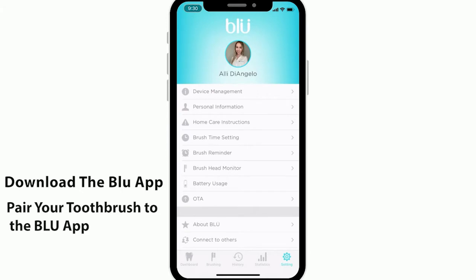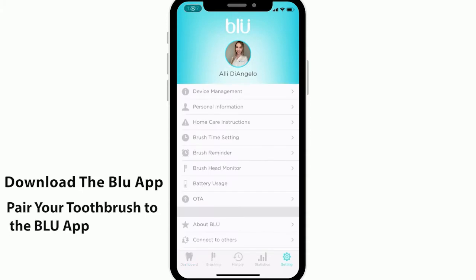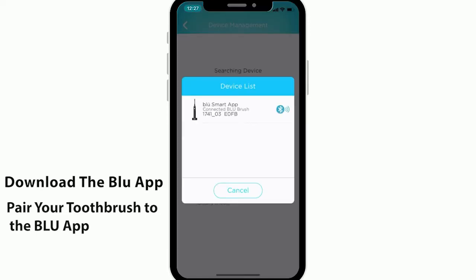When you hit device management, it will open a screen to pair your BLU toothbrush with your BLU toothbrush app. As you can see here, I'm going to hit pair device, and it will search for my BLU toothbrush, and it'll find the device, and I'm going to let that load. And once it finds my device, we can get ready to begin brushing our teeth after the full charge of your toothbrush.